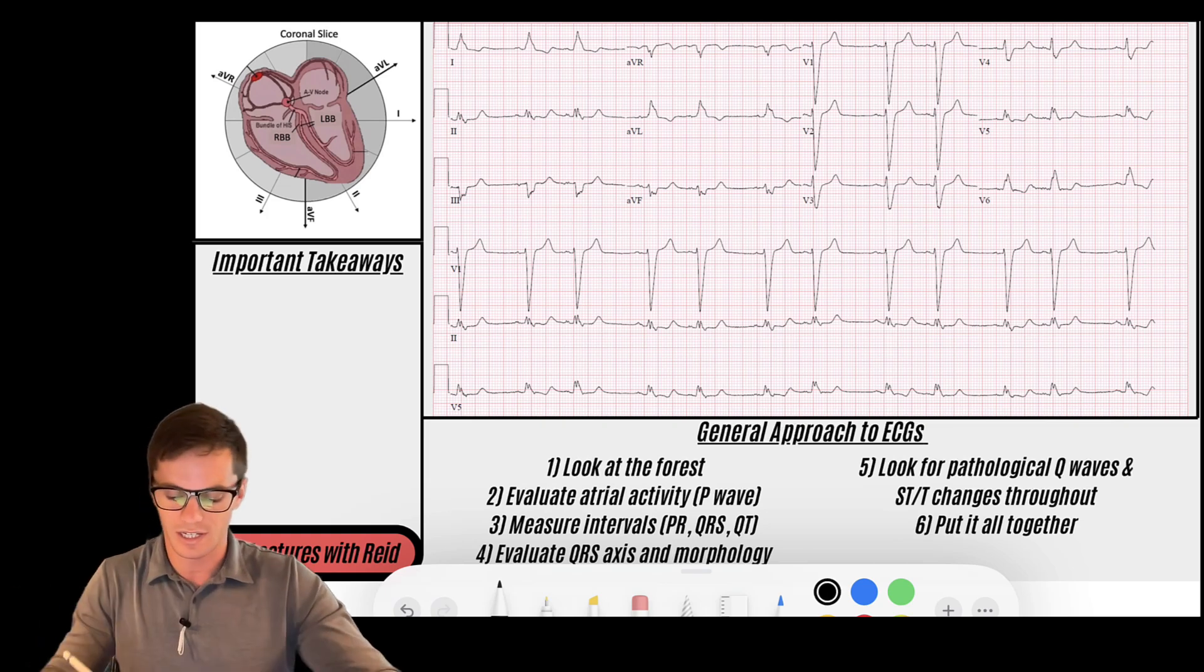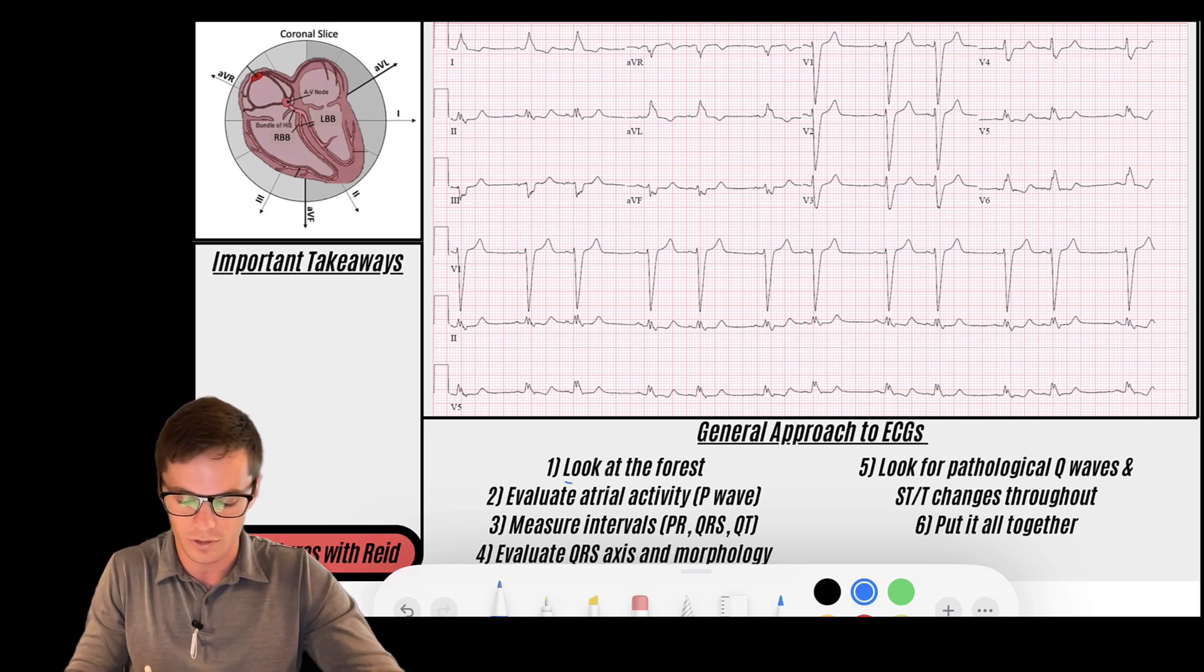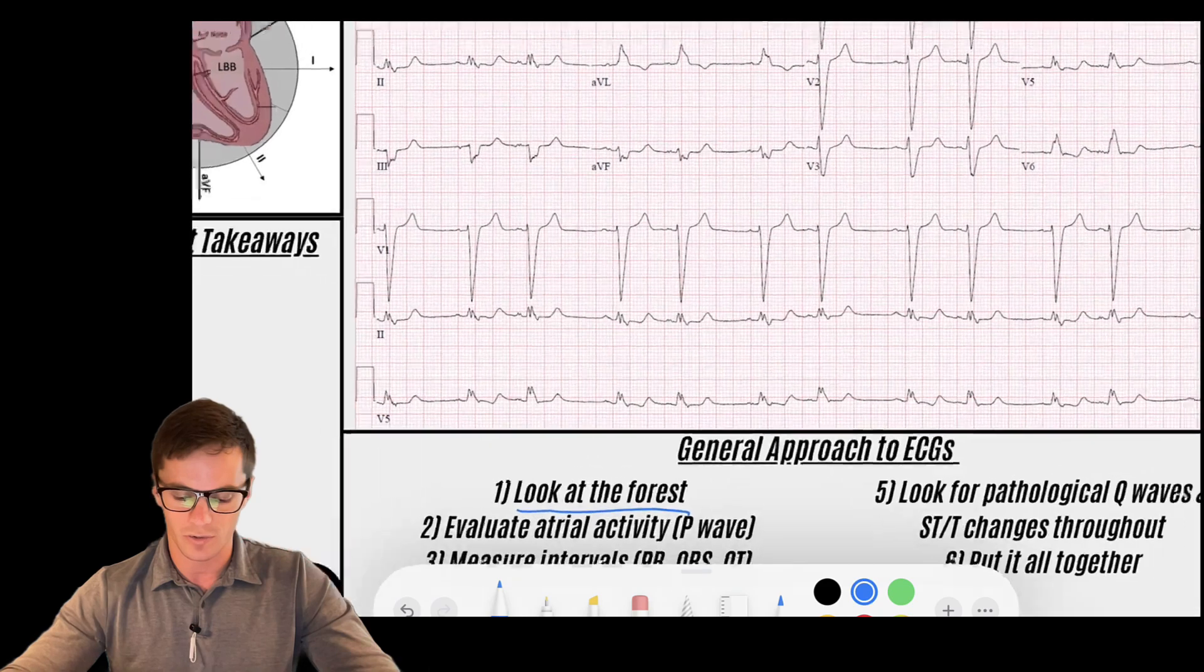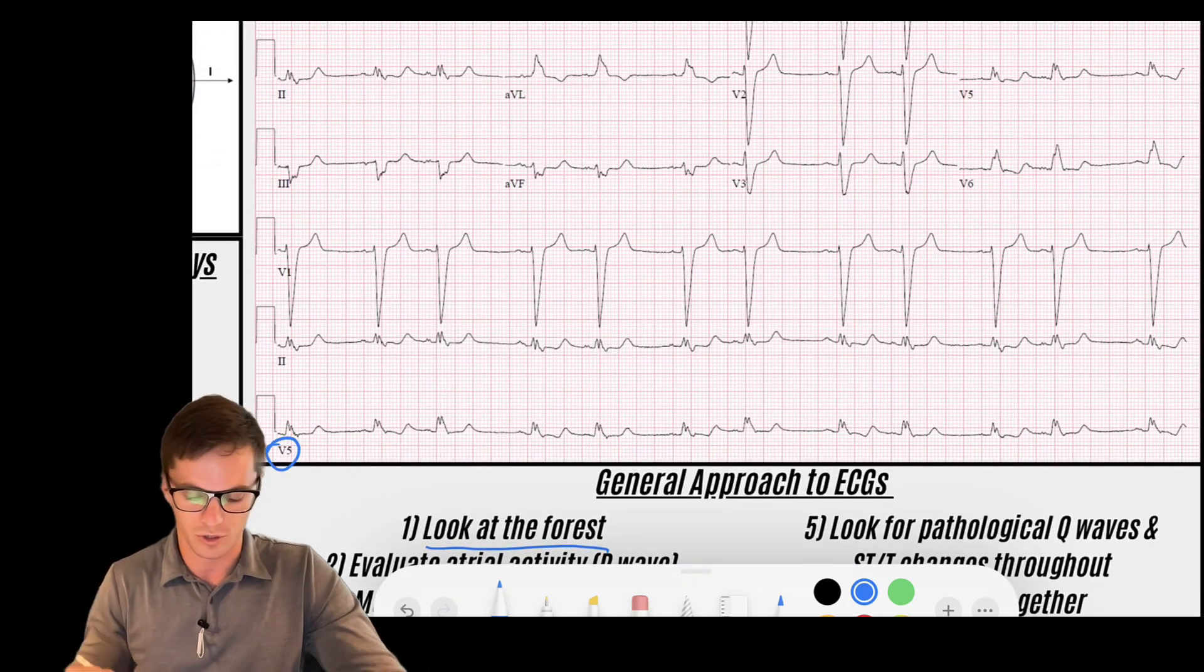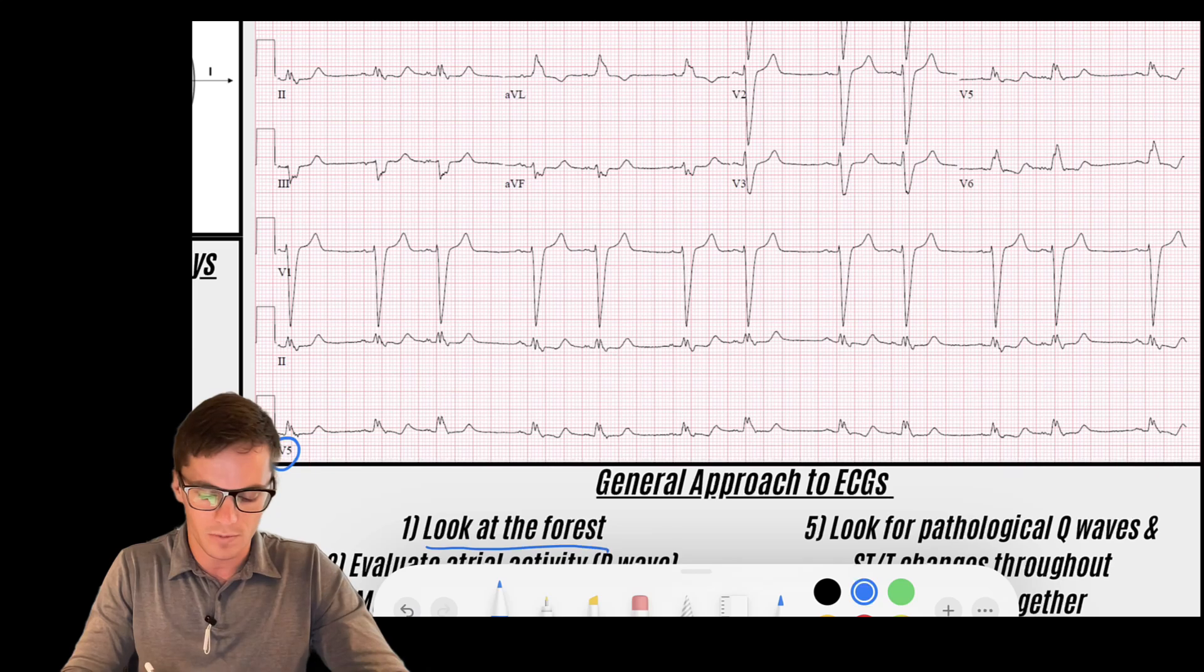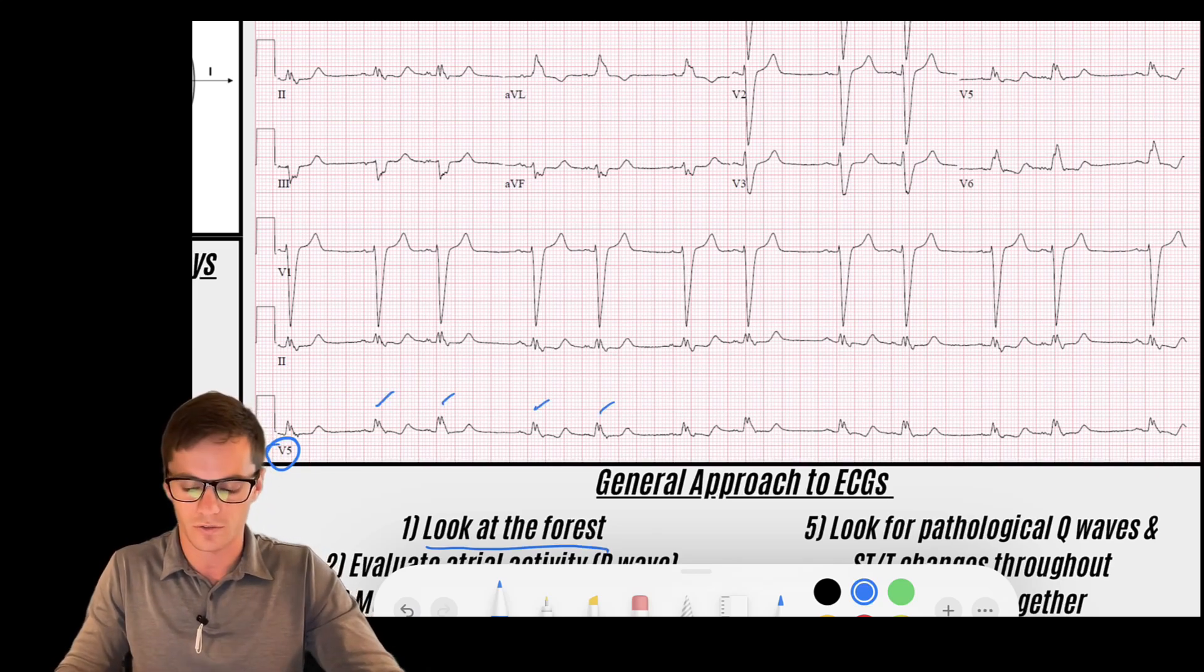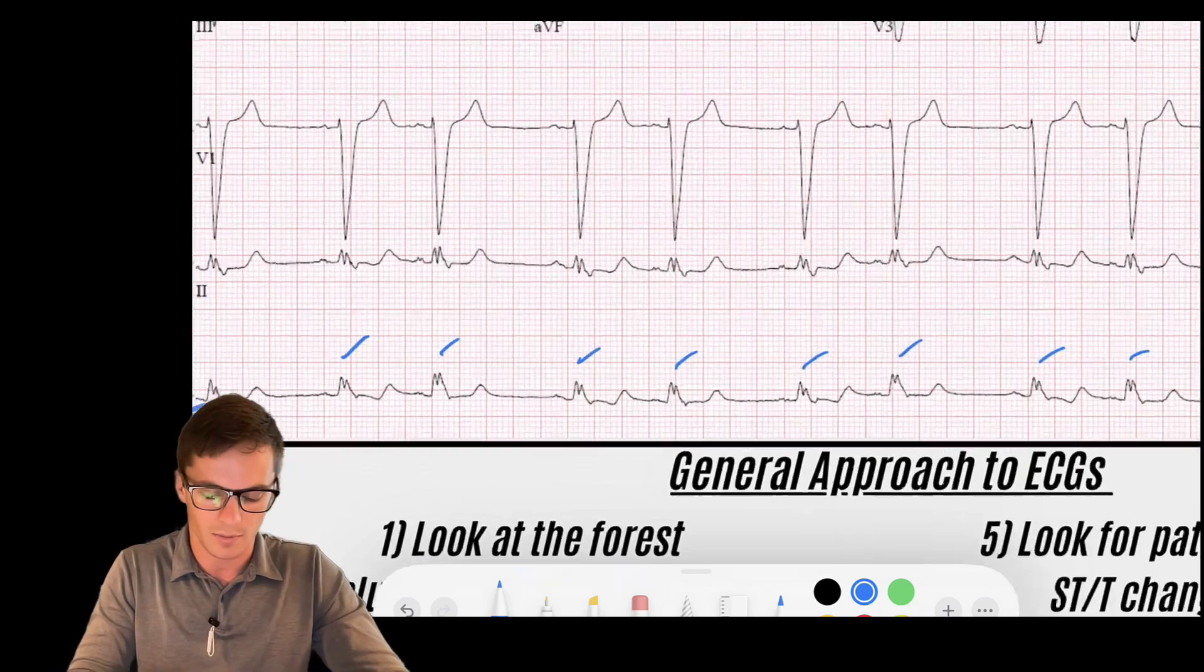Let's jump into this EKG. The first thing we're going to do is look at the forest and get an idea of what we think is going on with this strip. I'm going to zoom in and pick maybe V5 here, this rhythm strip, and I noticed that I've got what appears to be a wide complex rhythm and it occurs in these groups of two. I'm getting group beating, it's a wide complex.